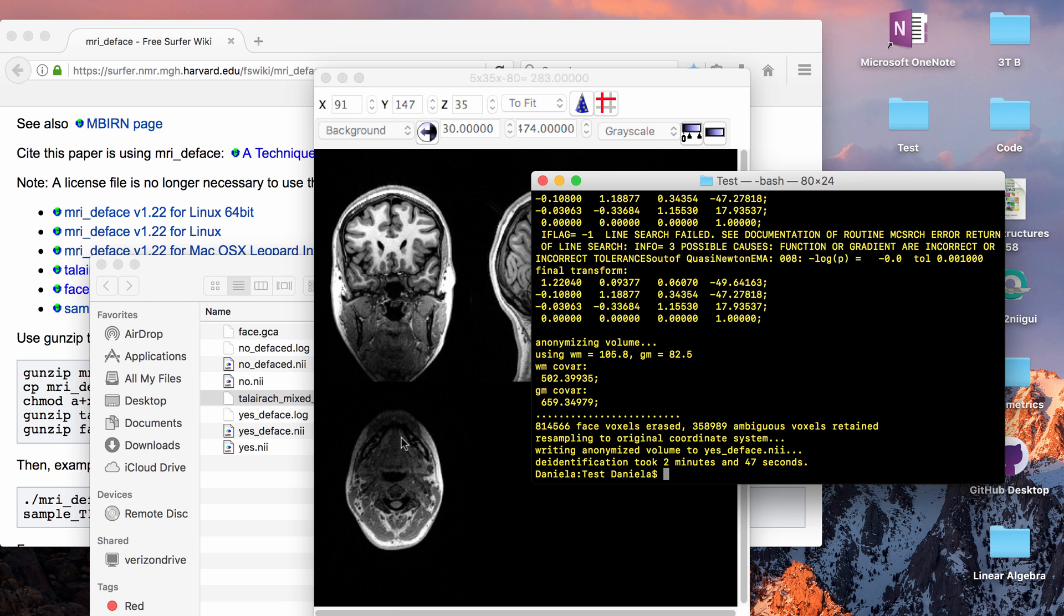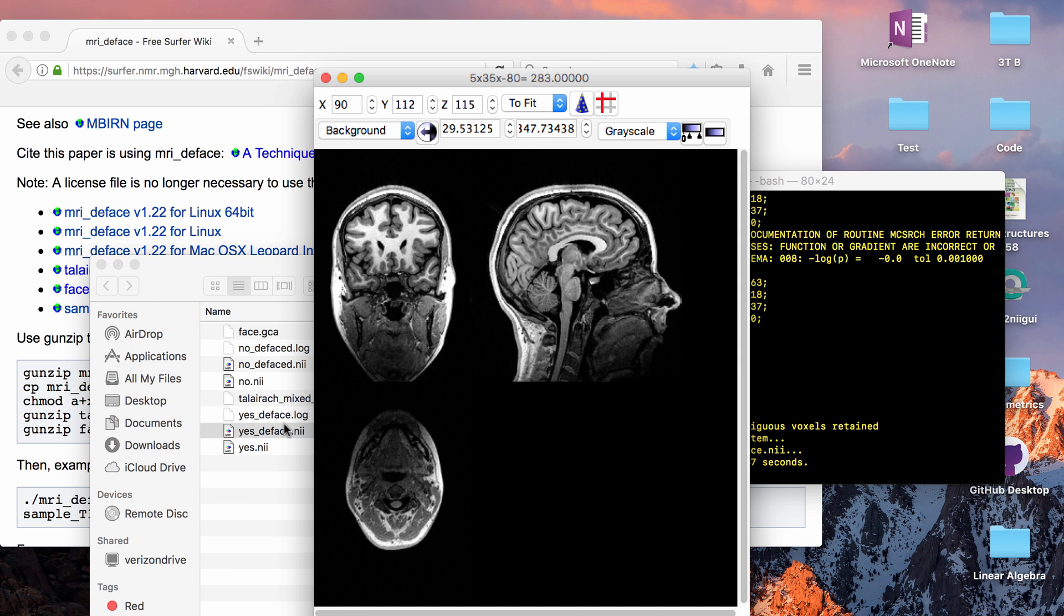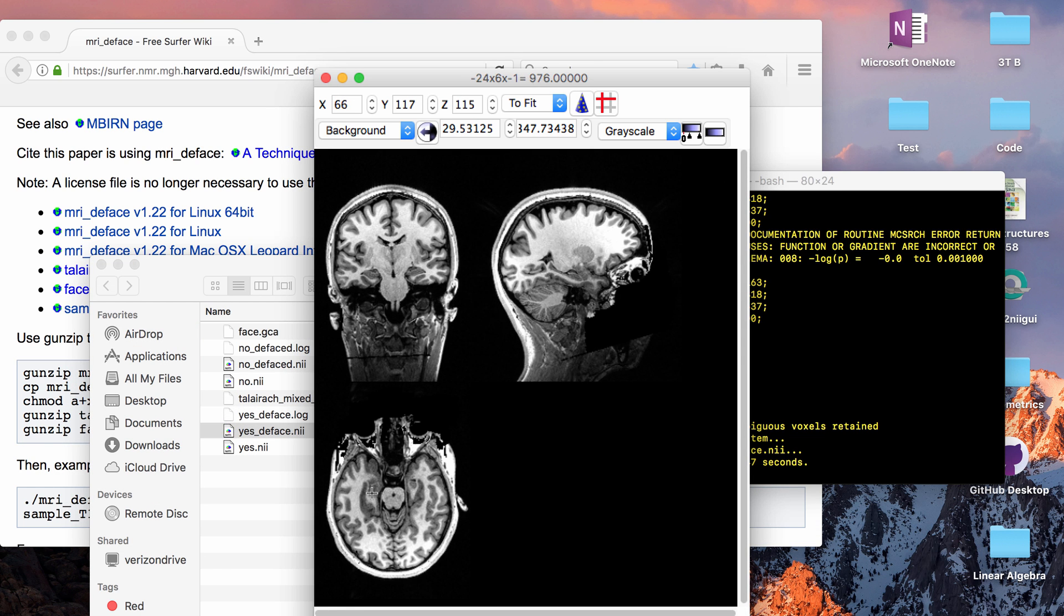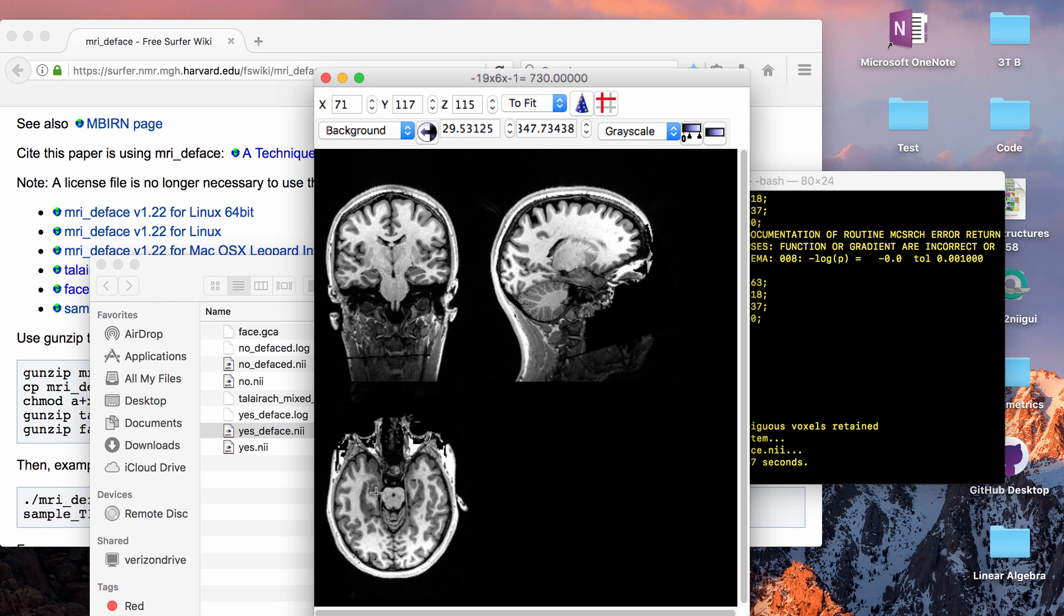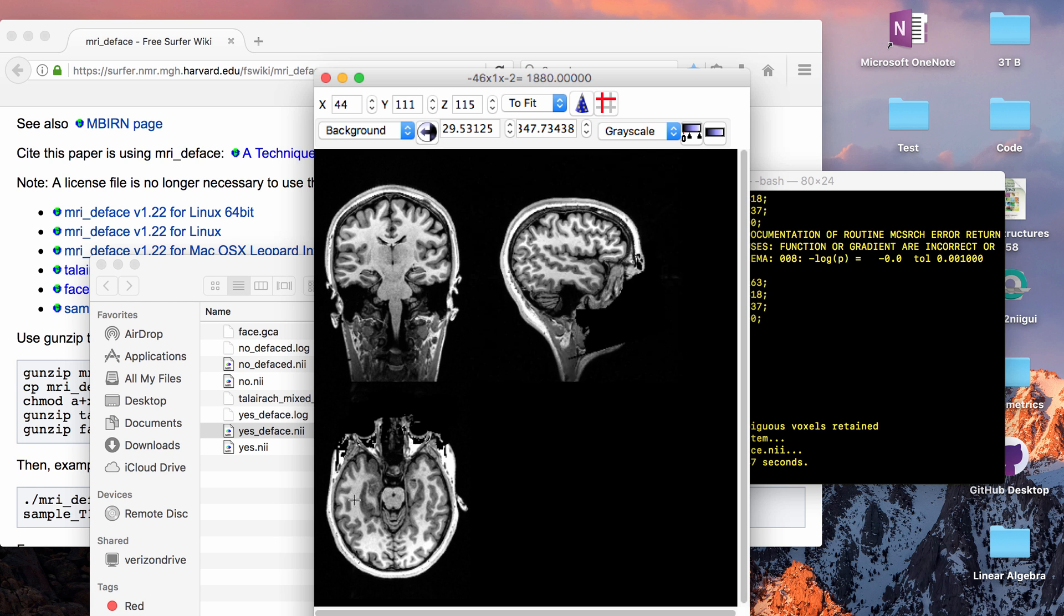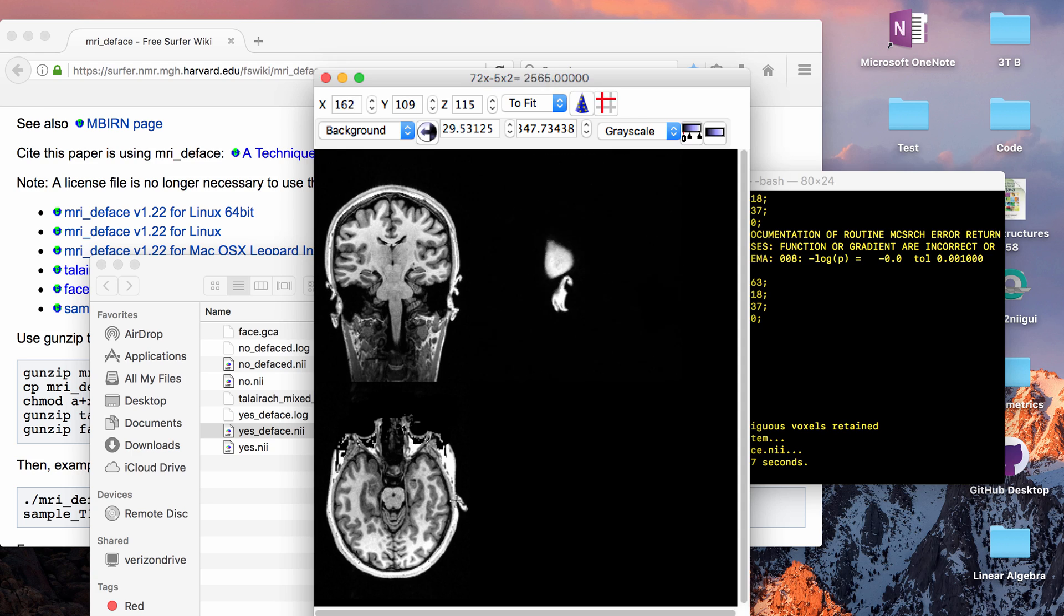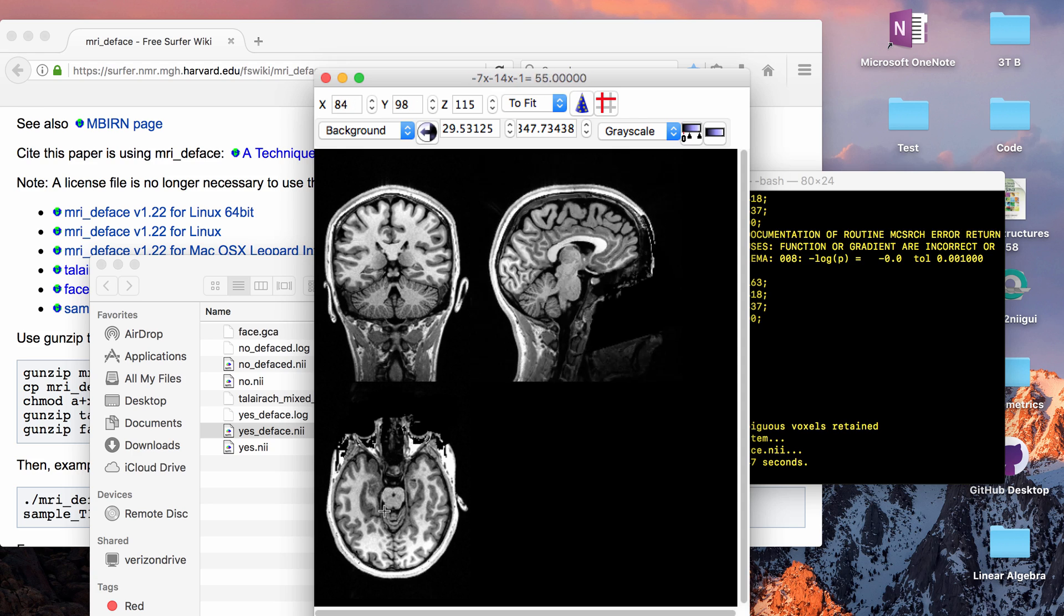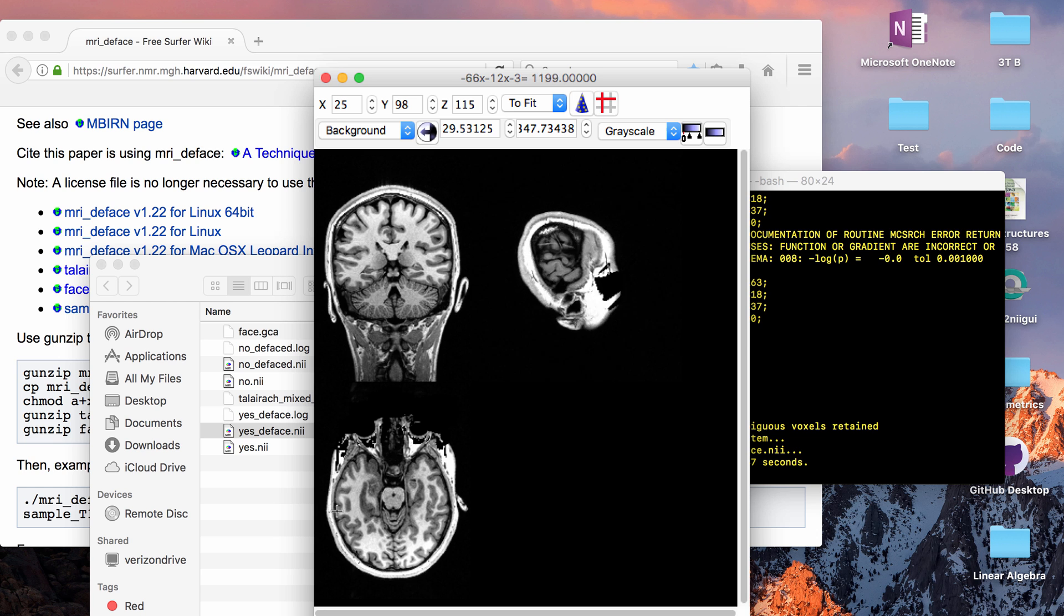Okay so that took less than three minutes and the result is much better so I would say that this one does work. It looks like it completely misses any brain and it does take out a significant portion of the front which has all the facial features. So this is an example of what MRI deface should do.